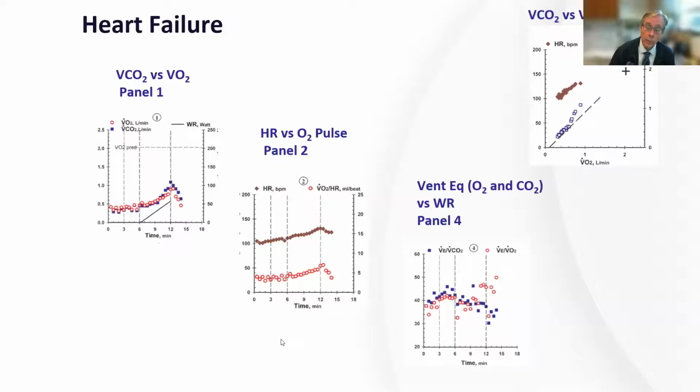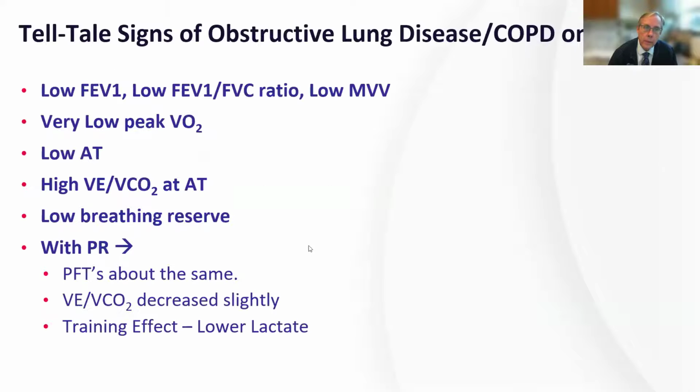So this is going to be suggestive or a telltale kind of presentation, but it doesn't diagnose it. What you need to do is put that together with the other data that we just talked about. Okay, so obstructive lung disease, this isn't a great way to diagnose it because you're going to have PFTs anyway.